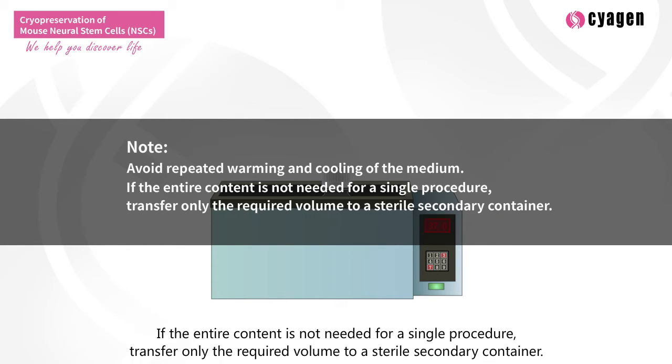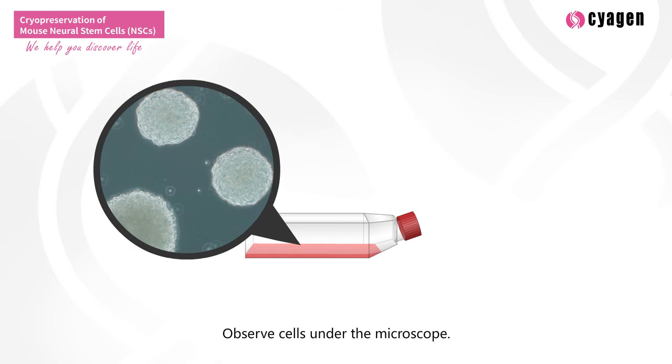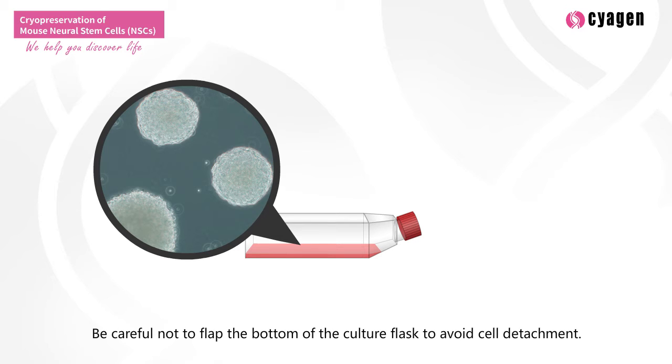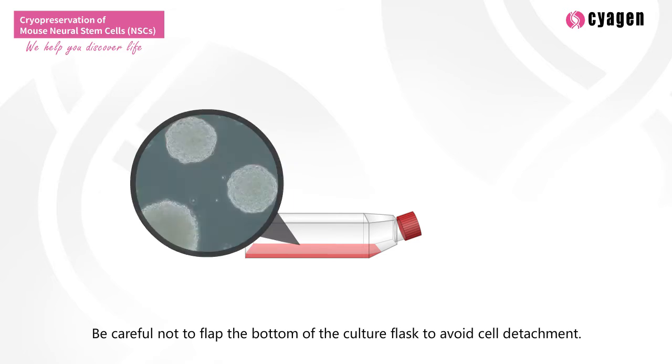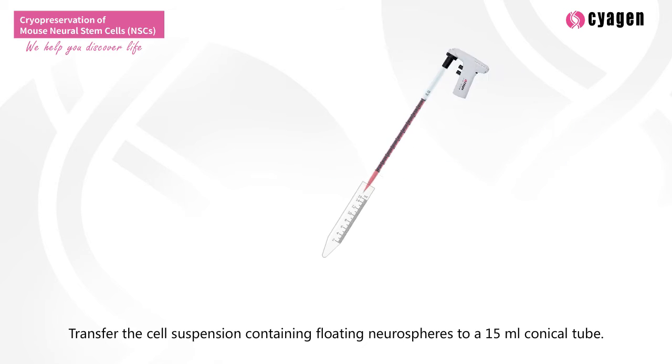If the entire content is not needed for a single procedure, transfer only the required volume to a sterile secondary container. Observe cells under the microscope. Be careful not to flap the bottom of the culture flask to avoid cell detachment. Transfer the cell suspension containing floating neurospheres to a 15 ml conical tube.